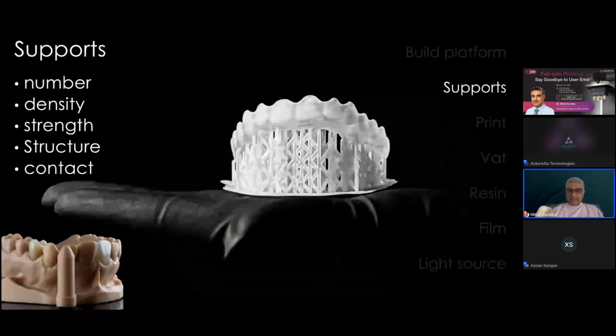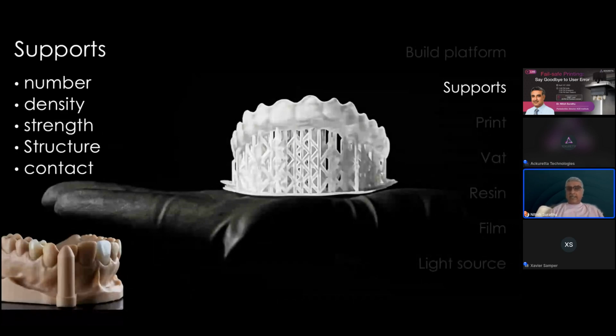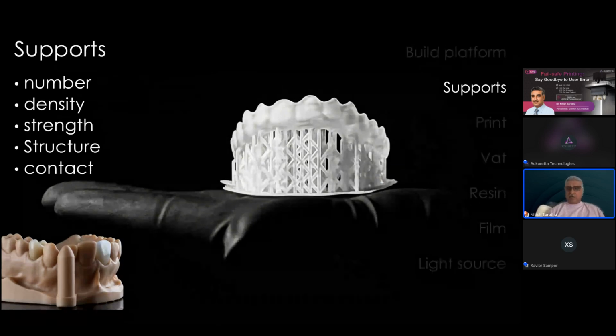These are resin supports. They are created by the slicing software, and they are a means of ensuring that any 3D print is supported. If you print directly with the print itself on the platform, then there is too thick a layer or too wide an area that needs to be printed at one go as a layer. Now that creates a significantly high peel force because your platform needs to fight your film to get a massive area of cured resin off the film. And that becomes hard for the printer to do.